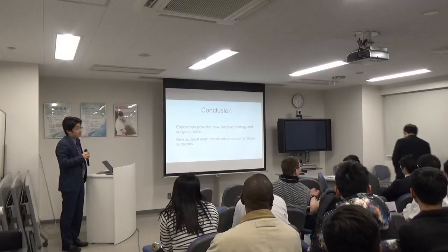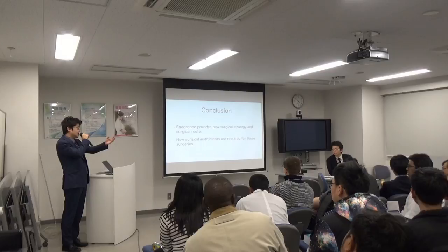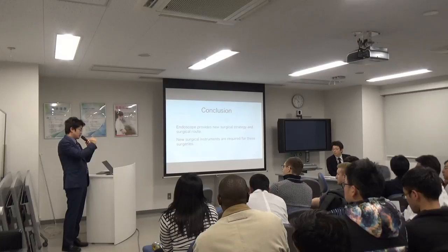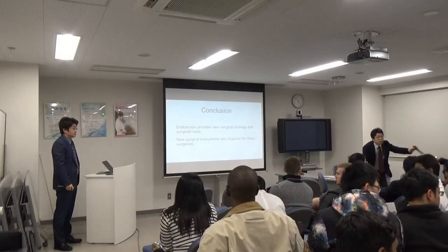Thank you. I would like to know how you control your blind spot. Blind spot? You use an endoscope, and you are seeing from the tip of the endoscope forward. How do you control it if you want to see backward? You use a dual endoscope, another endoscope, placed outside the cyst. Ah, okay. You can see the backward view. You don't have any recurrence of these tumors? No. Thank you very much. Nice presentation.